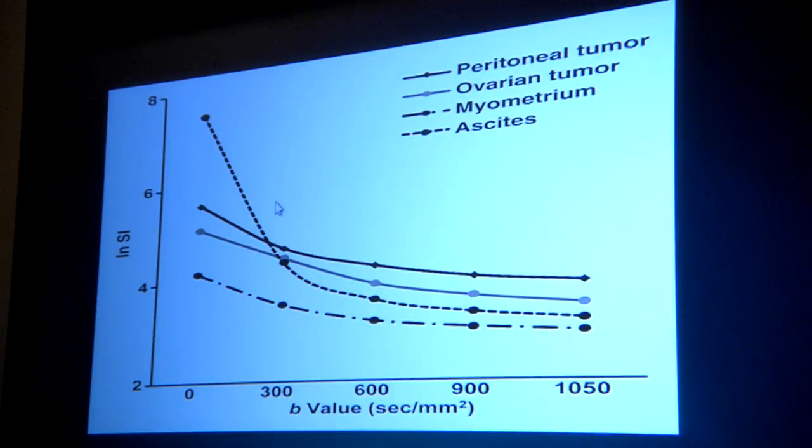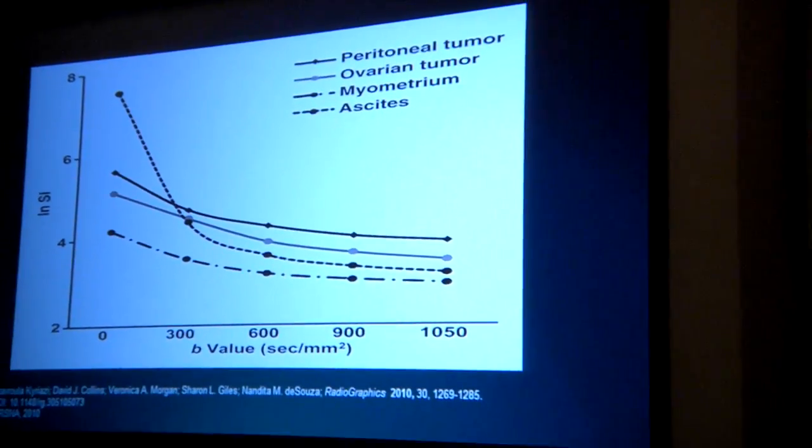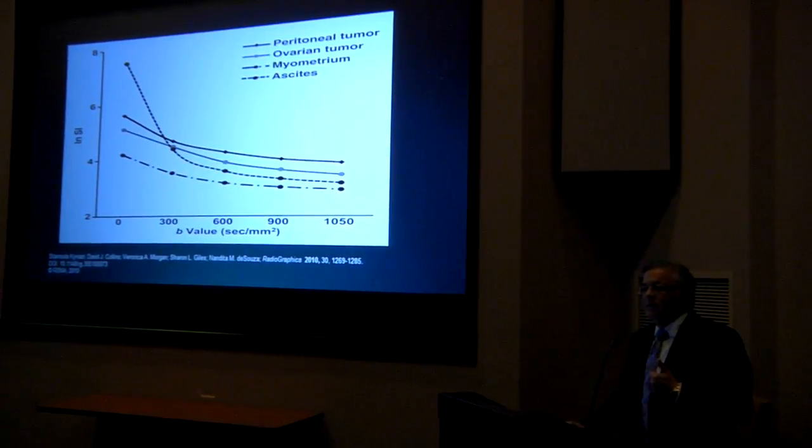So in doing our clinical patients, we produce two kinds of images. We produce an image which is referred to as a diffusion-weighted scan, and that is a T2-weighted scan, and what that basically means is that the bad stuff is bright. And we produce what is known as a calculated image from those sequences, which is an apparent diffusion coefficient scan. And I will show you why that is relevant.